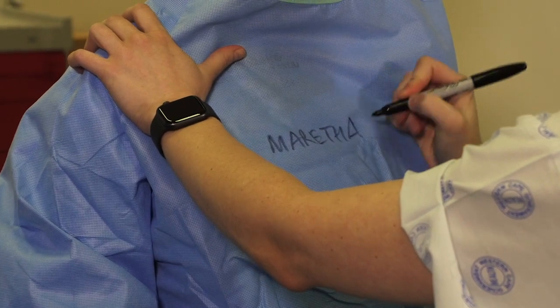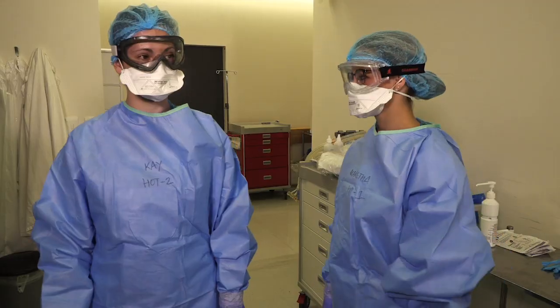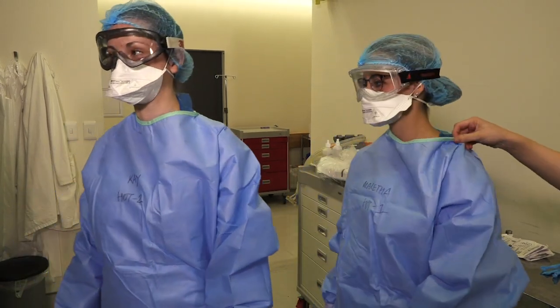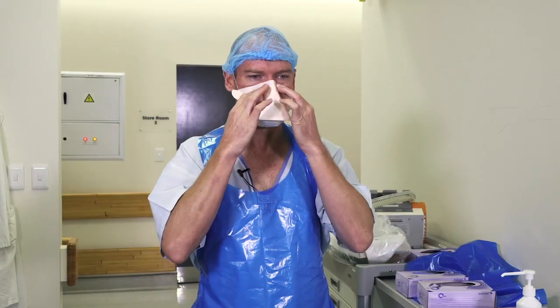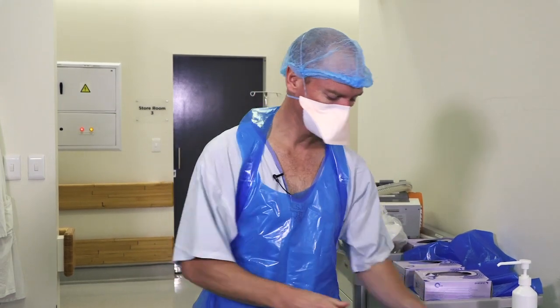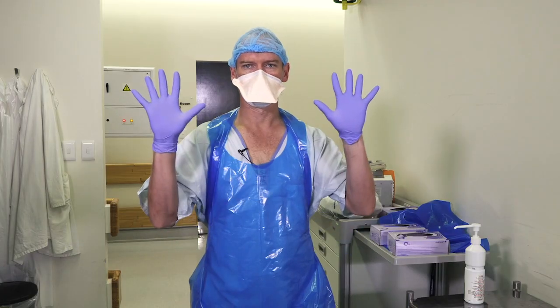Lauren, will you write their names and roles on their gowns? Will you both slowly turn around so that Lauren can check that you are properly donned and safe to proceed? I am in the not hot one role, therefore I must be wearing standard PPE with an N95 mask — apron, mask, gloves.